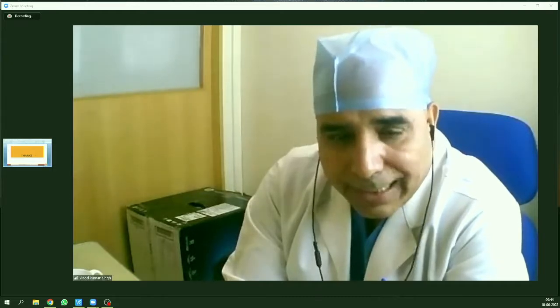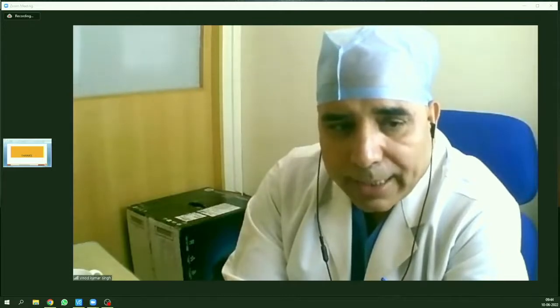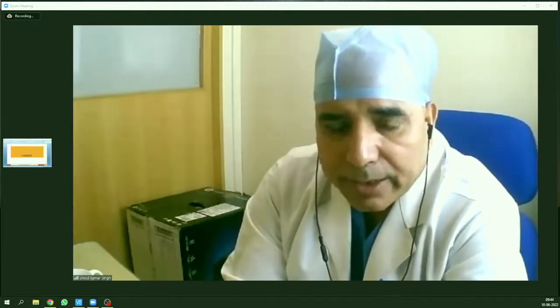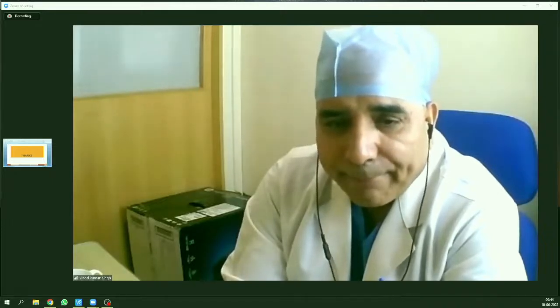You cannot keep quiet thinking the patient is being supported by the ECMO circulation. If the pulsatility has gone down, that means the heart will not recover. Got it? Yes. Thank you, sir.